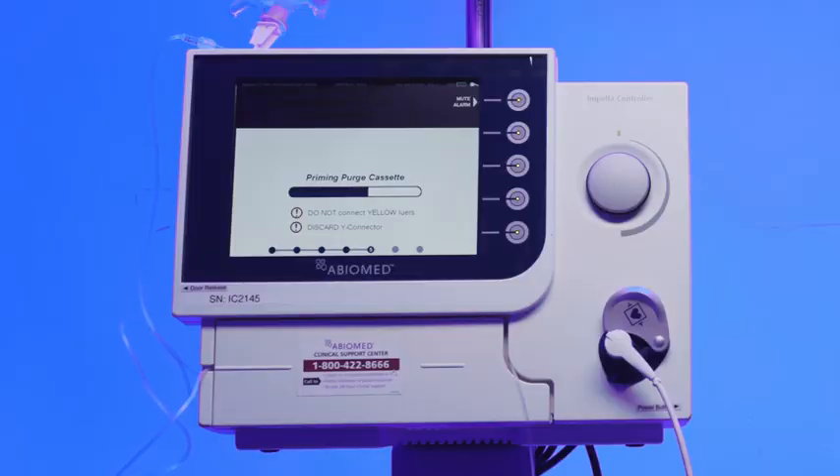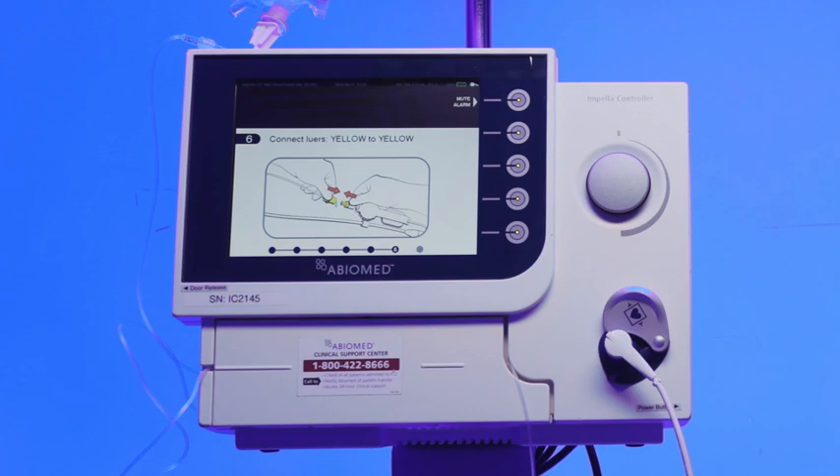A blue progress bar will appear while the AIC primes the purge tubing. Do not connect the yellow lure during this step. Once priming is complete, the AIC will automatically advance to the next screen.